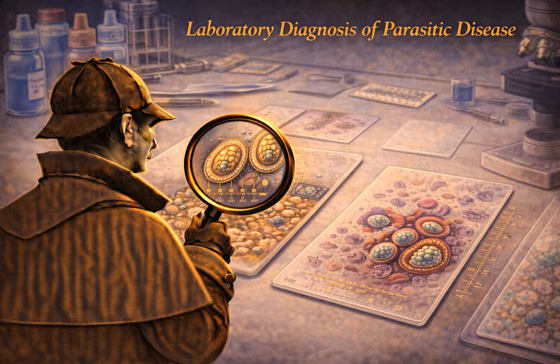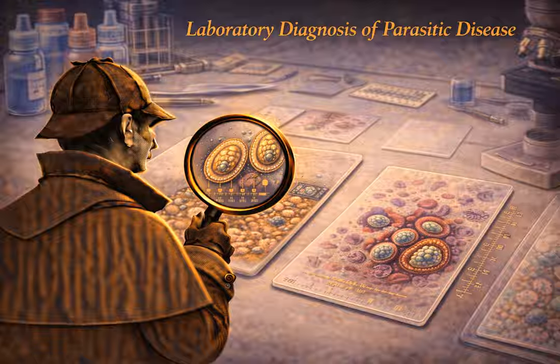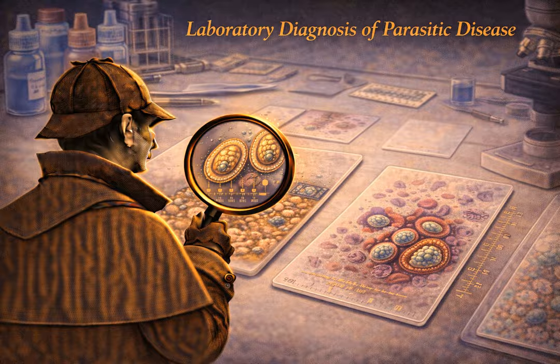If you take that lovingly formalin-preserved stool sample and send it down to the molecular lab for a PCR panel, you will get a false negative, or the machine will just error out and the lab will reject the sample. So if you want PCR, you need a completely different bucket. Yes, you absolutely need unpreserved fresh stool, quickly frozen stool, or you have to use a much newer, specialized preservative like Carry-Blair or Total-Fix that is specifically engineered to be compatible with DNA extraction.